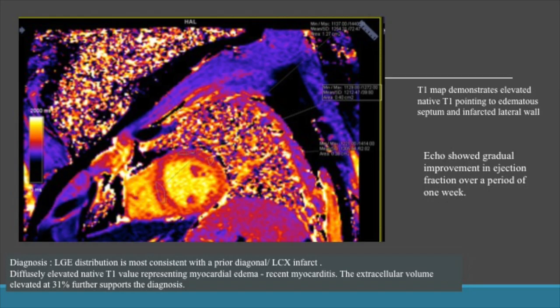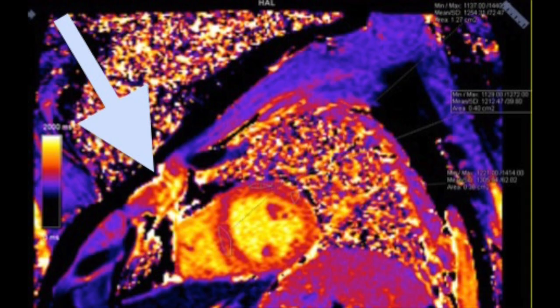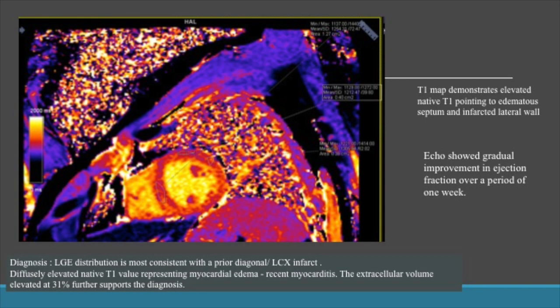The T1 map demonstrated elevated native T1 values in the septum as well as the lateral wall. The LGE distribution obviously pointed to the most consistent diagnosis of a prior diagonal or LCX infarction. However, it was the native T1 value which was the clincher of the diagnosis — its elevation representing myocardial edema and thus recent myocarditis, which explained the symptoms of acute chest pain. The extracellular volume was elevated at 31%, which further supports the diagnosis.